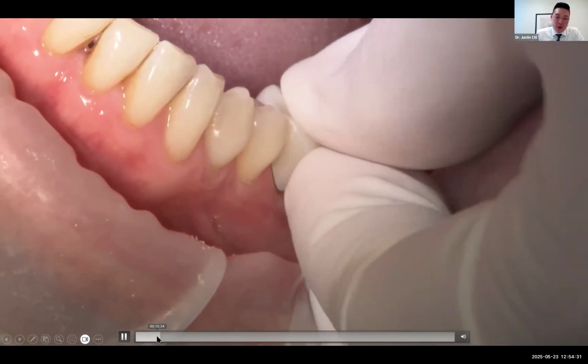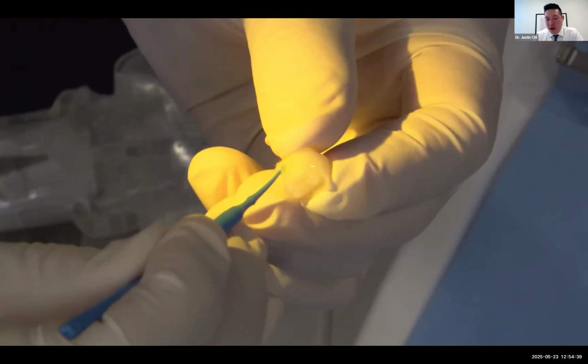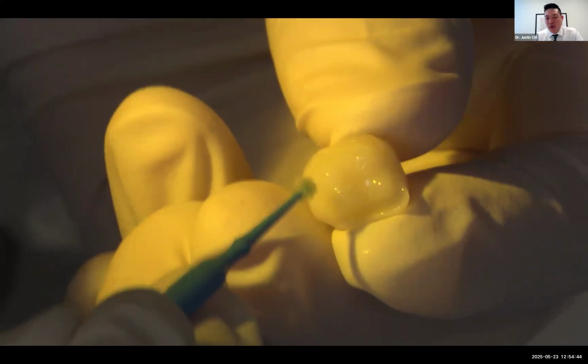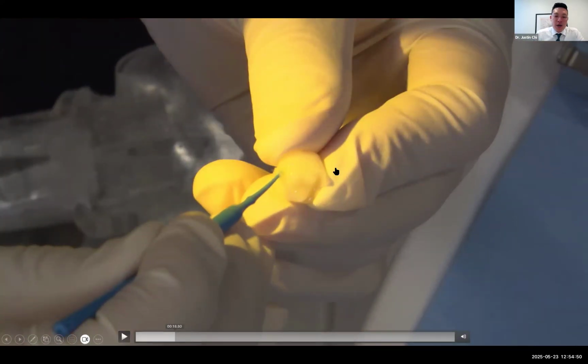So we try on, great fit. And after we try on, to pre-treat the material for bonding, we air abrade it. So air abrasion with aluminum oxide, or sandblasting with 50 micron aluminum oxide. A little tip for you, something that we do, I know it's not shown here, we're going through the bonding.